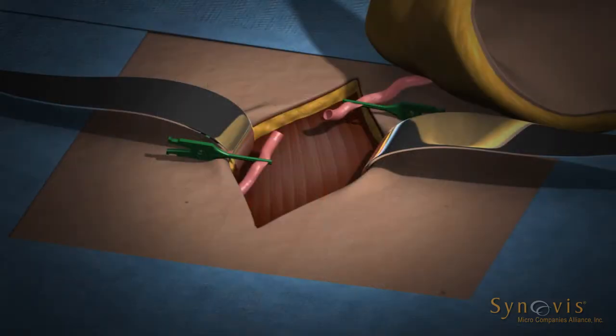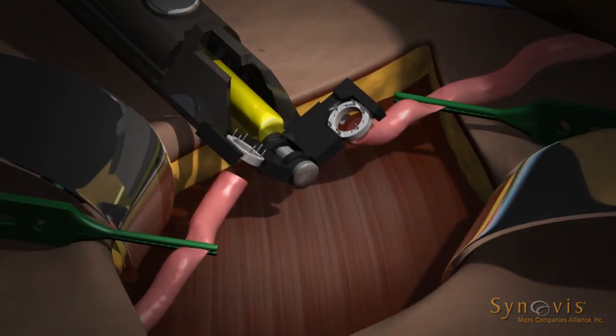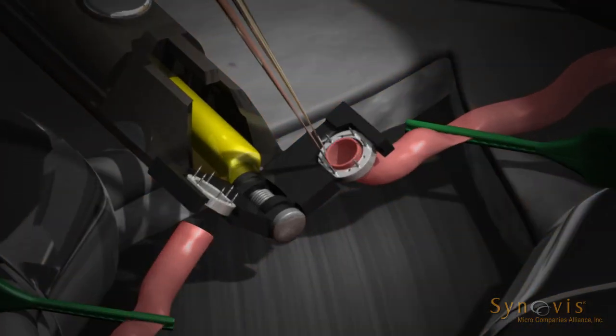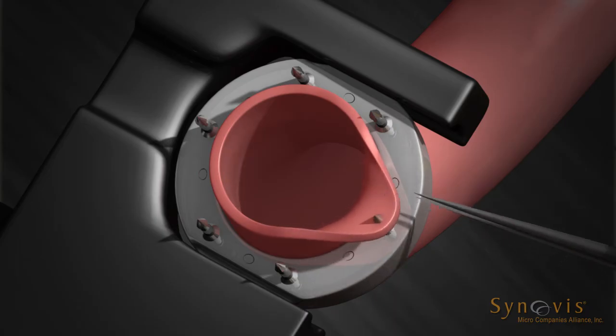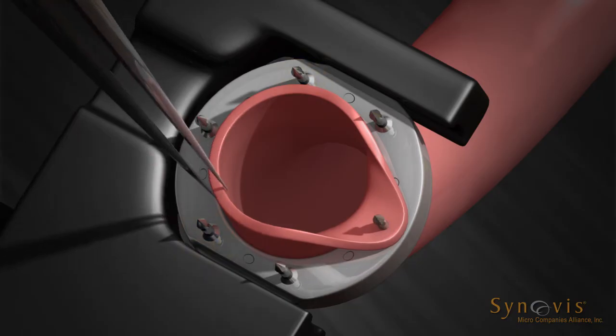Place the anastomotic instrument perpendicular to the vessels with the coupler jaw assembly near the two vessel ends. Pull one vessel end through one of the coupler rings using forceps. Take a bite of approximately one to two pin diameters of the vessel wall and intimal lining. Evert 90 degrees and impale onto one pin. Proceeding in a triangular fashion, impale the vessel firmly onto every other pin, completing three pins.